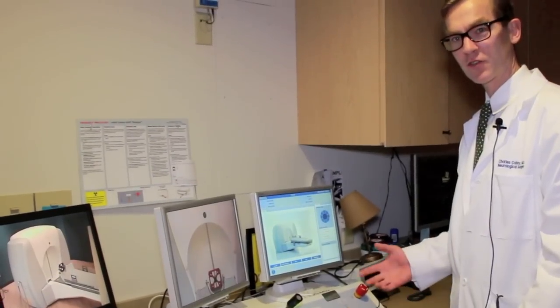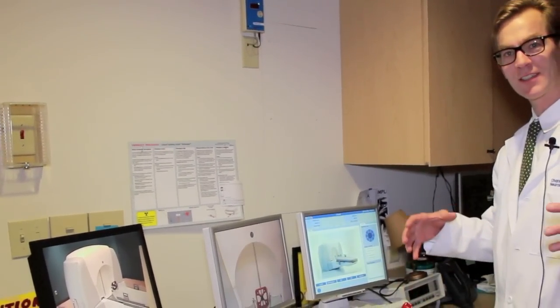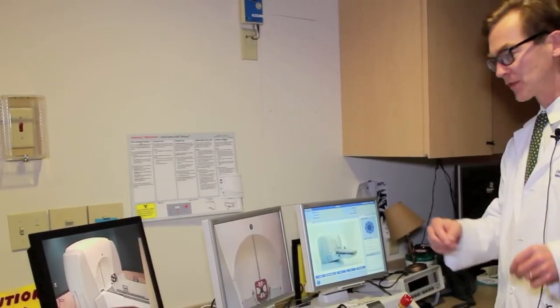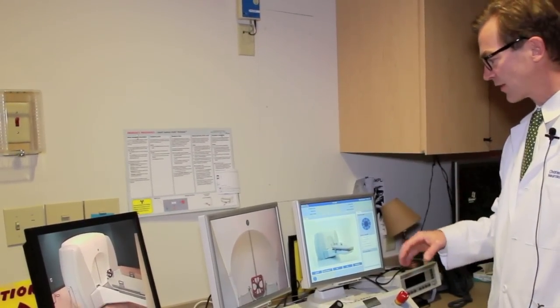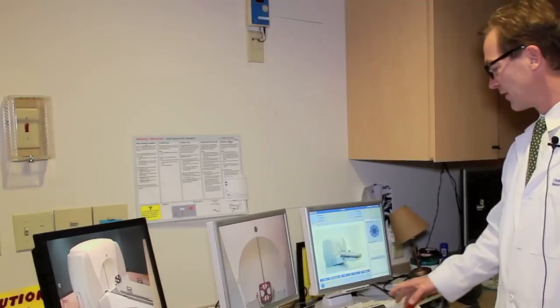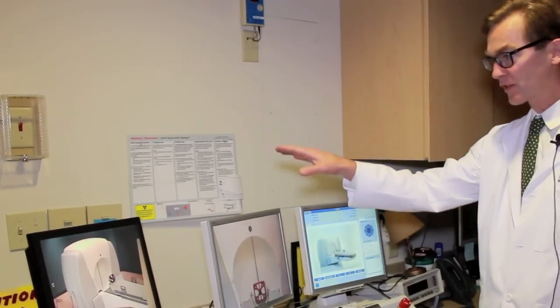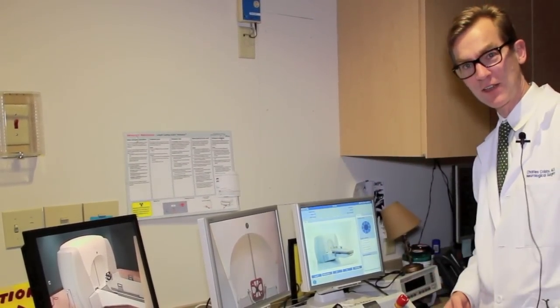Here we are at the control desk for the Gamma Knife, which uses cobalt-60 radiation beams called gamma rays that shoot down at one focal spot. This is the control for the machine and we can watch the patients inside. Let's go inside and see the device.